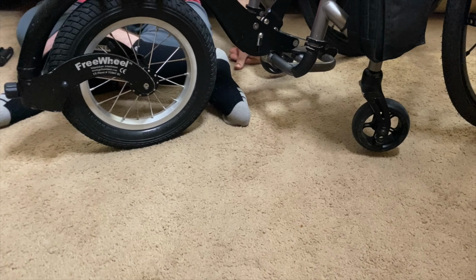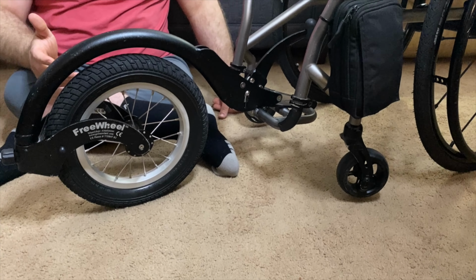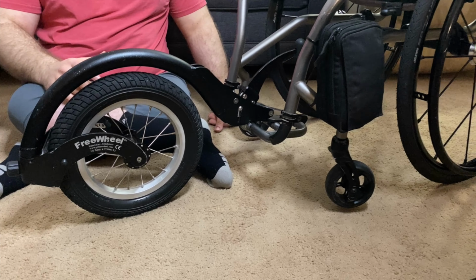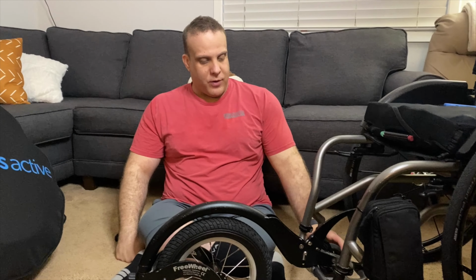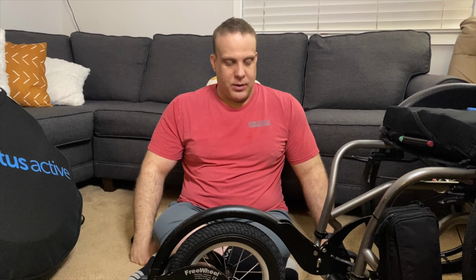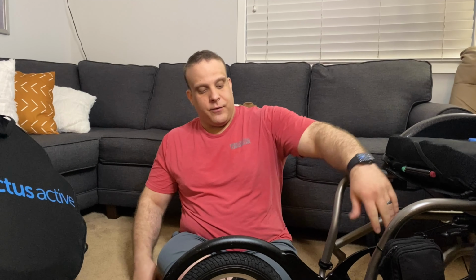This makes weight displacement in the sand on the beach a lot better because it displaces the weight over a wider area, so my front wheels don't dig into the sand as much. And when I'm using it on other trips going over rough terrain, I don't have to worry about my front casters digging into a crack on a sidewalk or a root on a tree or something like that. So that's how it goes on the front when I am using it.